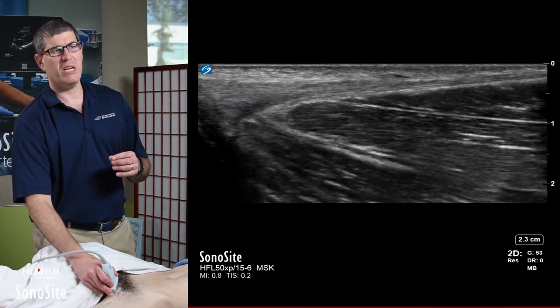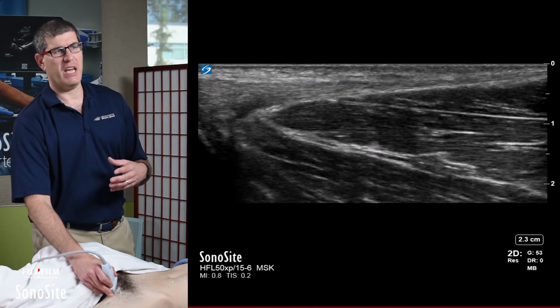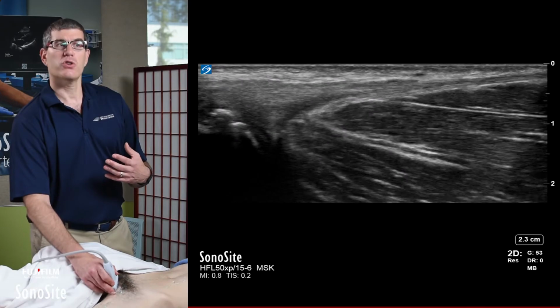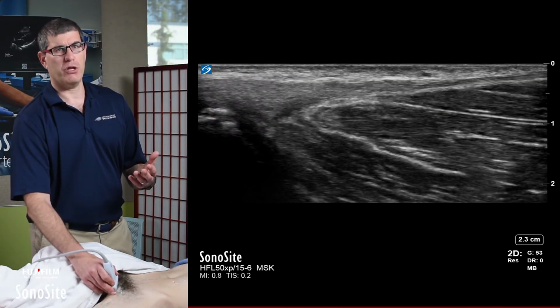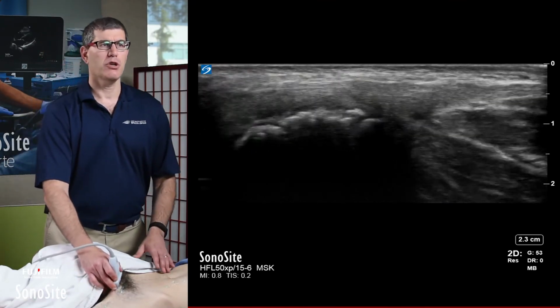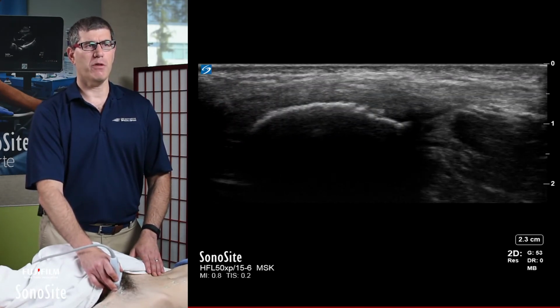You may also see classic tendinotic changes, such as focal thickening. You can lose some of the normal fibrillar architecture, or you may see a hypoechoic architecture. Certainly concordant pain would be an important detail, knowing whether you have pain or tenderness to palpation through the probe. You may see some cortical irregularities. You may see some lifting off of the bone.